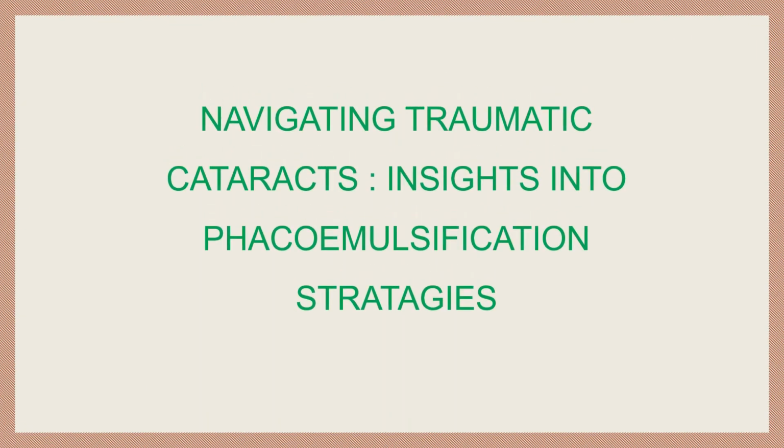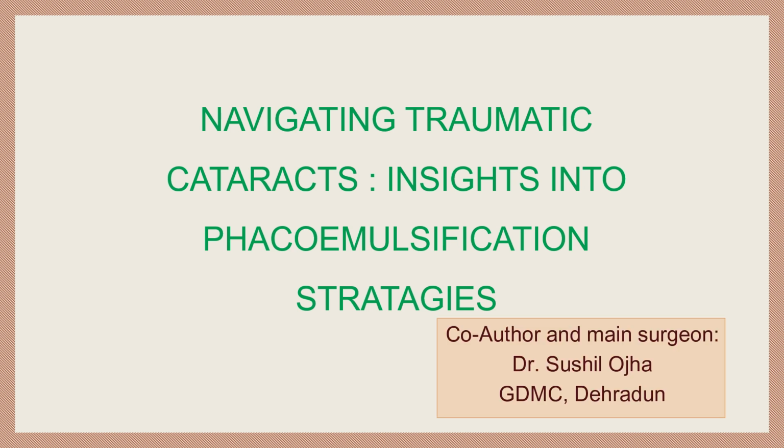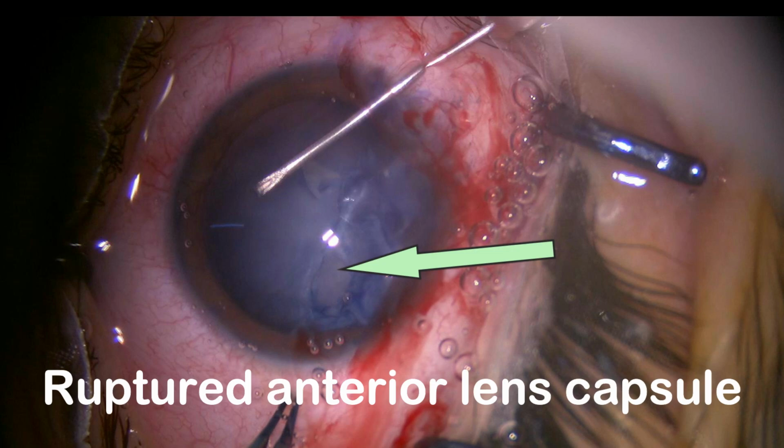In this video, we will discuss phacoemulsification strategies in traumatic cataracts. Let's go through case number 1. This is the case of traumatic cataract with ruptured anterior lens capsule.